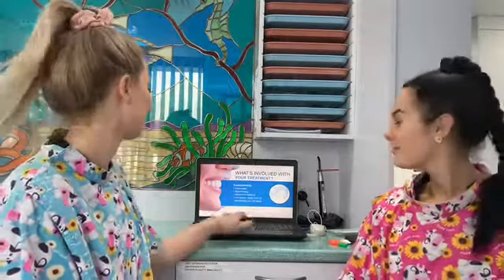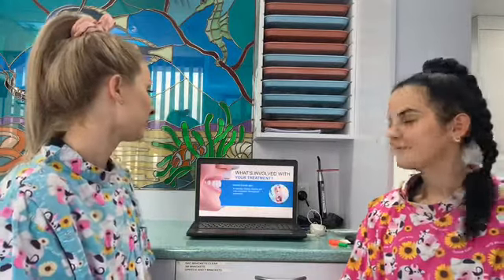With losing aligners, make sure you keep them all in a really safe spot because if you do lose them, it is an additional charge to you for us to order some more. And then sometimes we can get some manufacturing errors. So sometimes they might send us 2 uppers or 2 lowers in a pack, or an aligner might be completely distorted. If this happens, take a photo and send it through to us and we can order some more on warranty for you. So we also just want to make sure that you're keeping up with your regular dental checkups every 6 to 12 months as well, just to make sure everything's healthy.